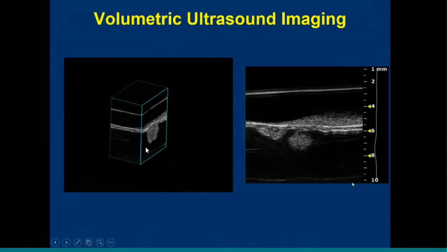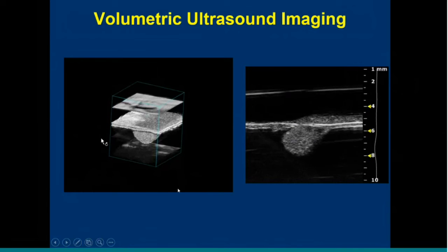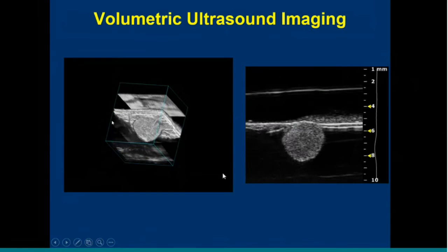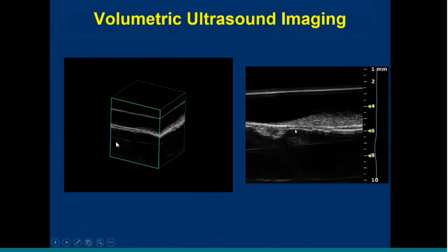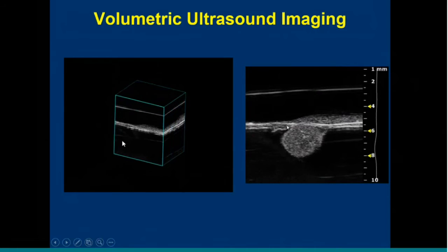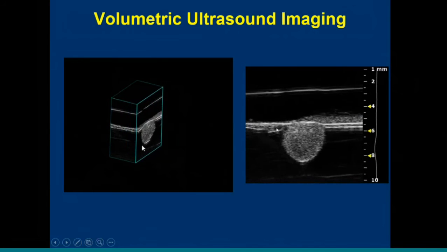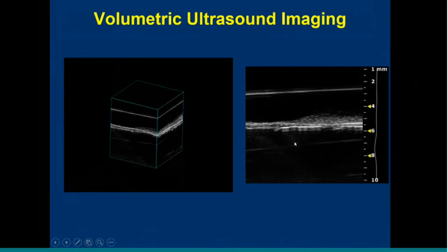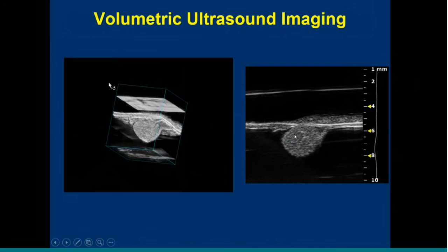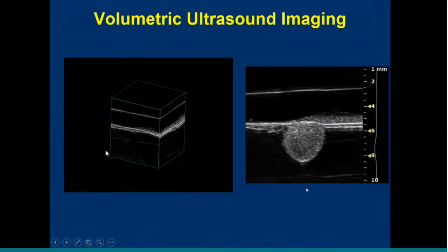We're just stepping through the different planes here, and we're going to go to a rendering where you can see that the tumor itself is well encapsulated from the surrounding CAM tissues. This means that any segmentation that you do on the tumor is going to be very repeatable, both if you do it multiple times, to test how well an operator segments the tumor, but also between operators. We've had a summer student do the same segmentations that I've done for analysis, and our results are really, really close together. And this, of course, means that we're getting a very precise, very repeatable estimate of tumor volume.